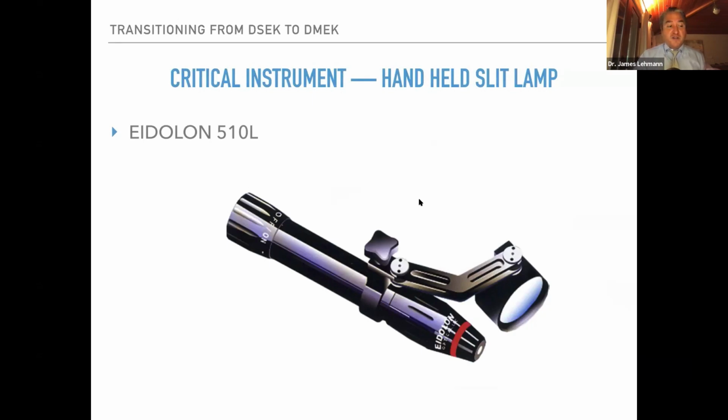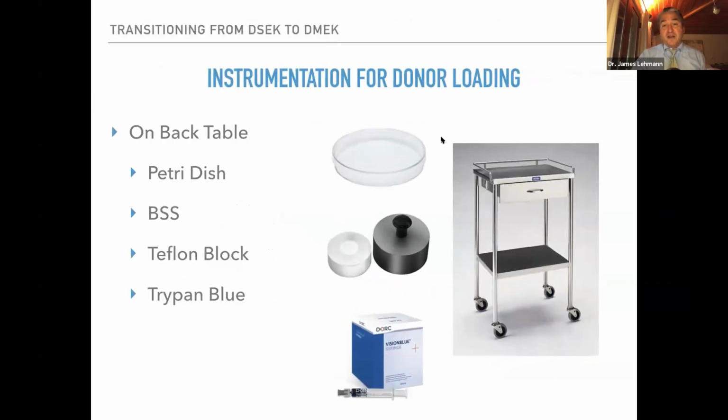Now, there's many tricks for this, so you can learn other ways, but oftentimes, even if you use the S stamp, it gets distorted. And if you don't know how to determine the graft orientation, except for the S stamp, then you're kind of in trouble. So always need a backup. And what I use is this handheld slit lamp. And so I'll show you some pictures of that.